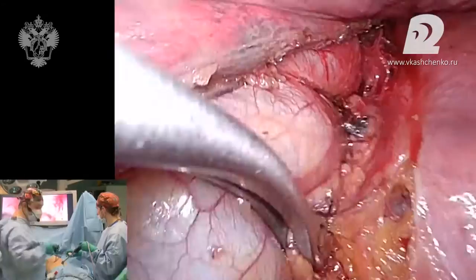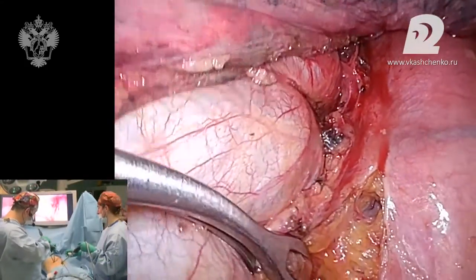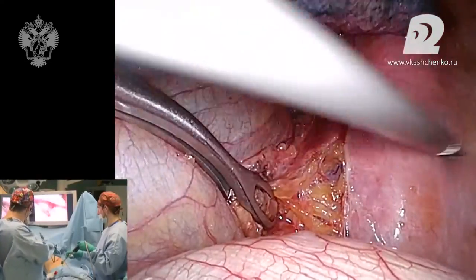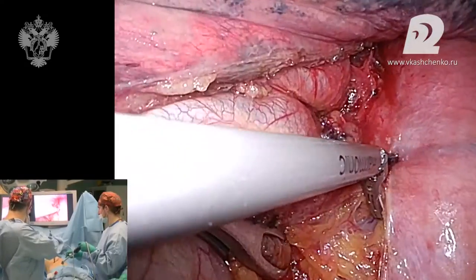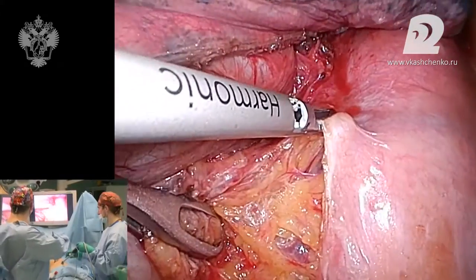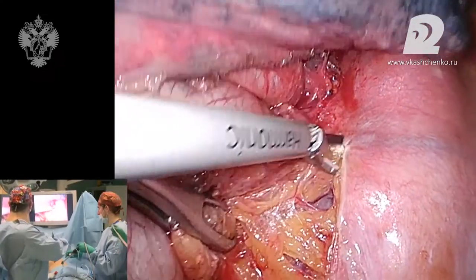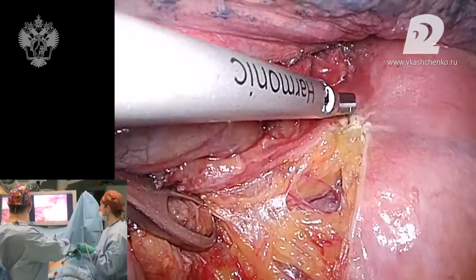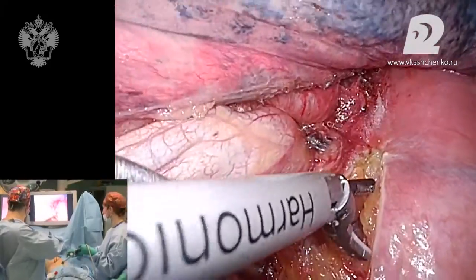The superior upper border of the tumor is at 30 centimeters, but on CT it's under the bifurcation, one vertebra down. It's the mid part of the chest. That's why I would like to see this border from the right bronchus.